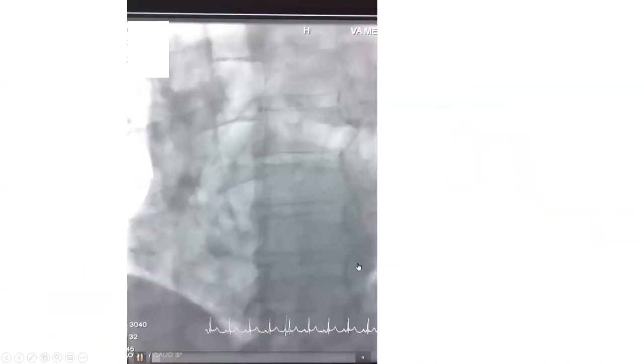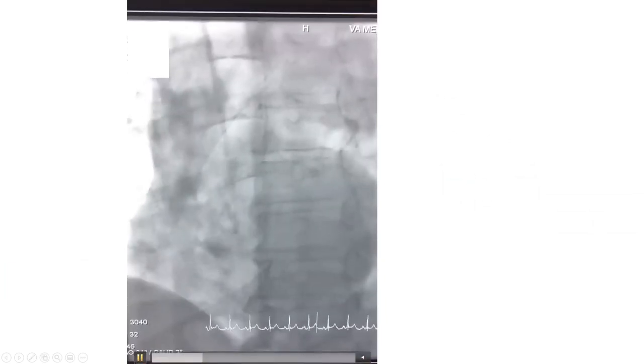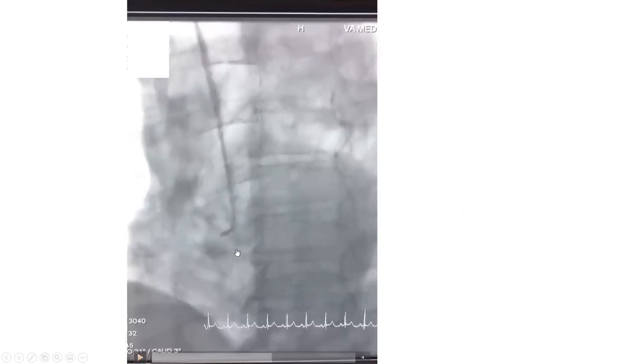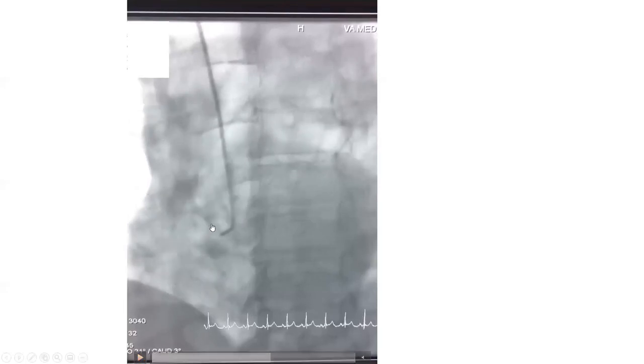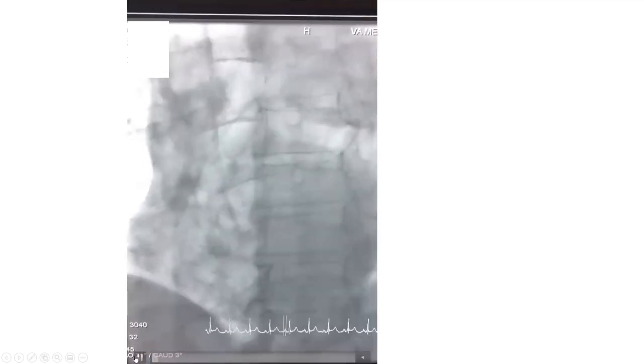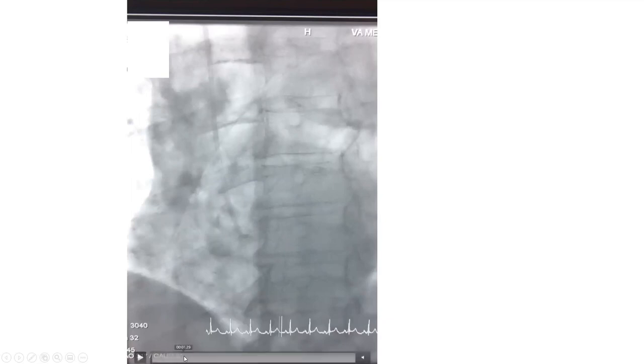Here's an illustration of troubleshooting by a fellow. The catheter was on the right cusp, the fellow clocked and pulled, and as he clocked and pulled, he came below the coronary. So he just pulled it all the way up — and that rarely works. You need to recognize the first puff: you're seeing the cusp, that nest-like sinus of Valsalva, which means you're below the coronary ostium, usually at the top of that nest. He went from too low to too high. The correct maneuvering is: when you clock and come below the coronary, don't just pull it out. You can reverse your torque and try again with more pull, or better: counter-clock a little to make it look toward you, then pull, then clock again. If you just pull straight, the catheter will fly out and you'll be out of plane.